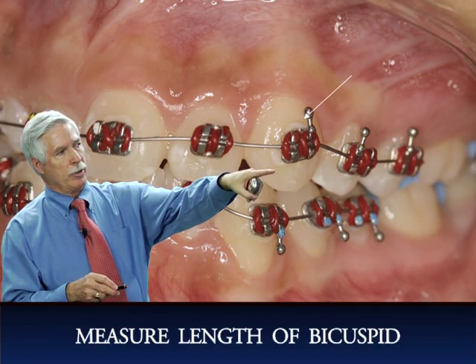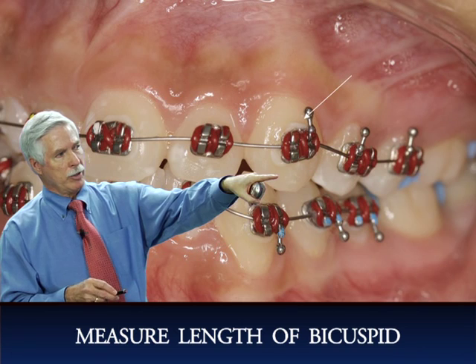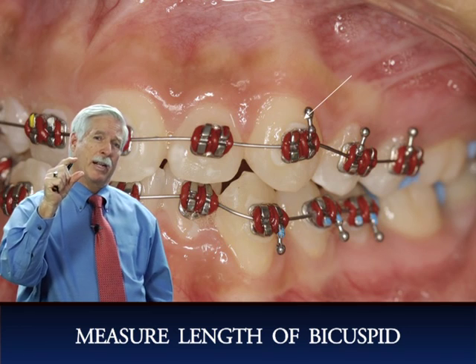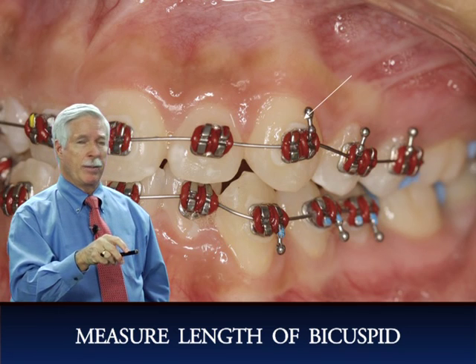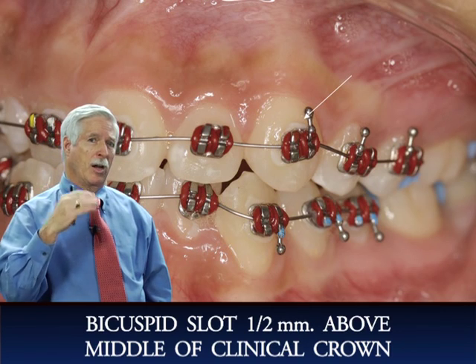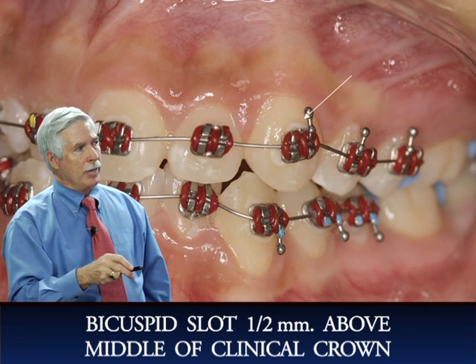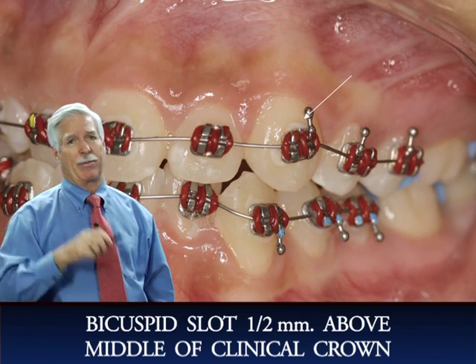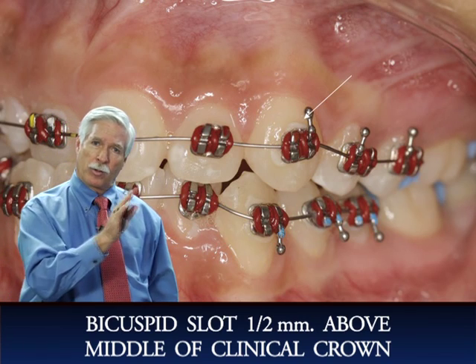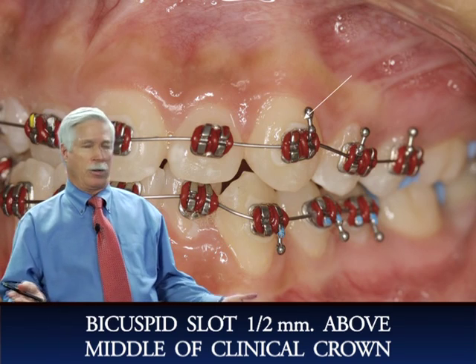What you do is, again, from the gingival margin to the tip of the bicuspid, measure, say that's 8 millimeters, and that midpoint would be 4. So you find the midpoint 4, and then go gingivally 0.5 millimeter. Okay, so the bicuspids are middle plus gingivally 0.5 millimeter up, and the centrals and laterals are midpoint and move incisally 0.5 millimeter, and the cuspids in the middle. So really, it's a very simple way to put brackets on. But remember, all those cardinal rules I told you are very, very important. But if you don't get one bracket on correctly, don't worry about it, because you can always change the bracket.